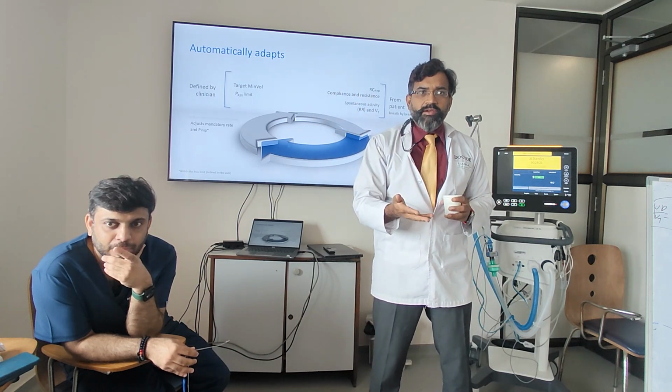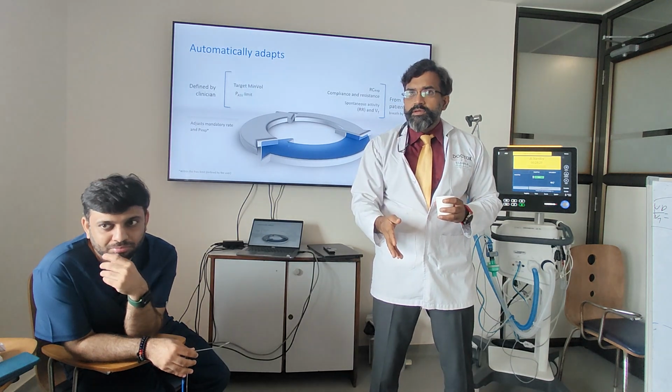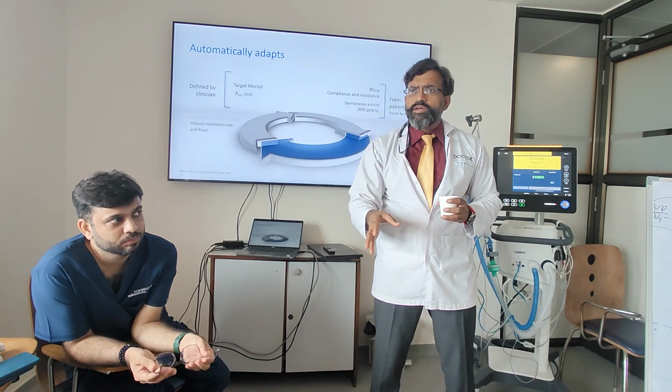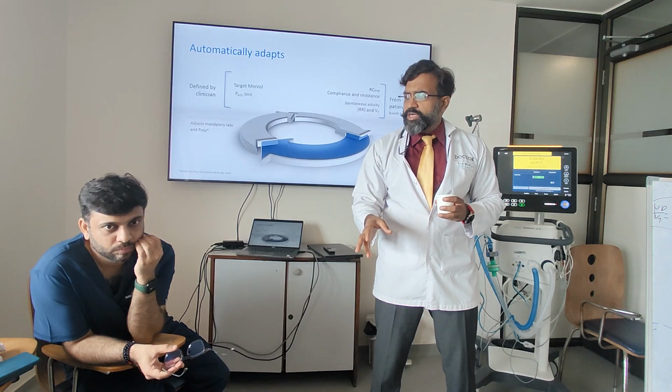But what is effectively happening? In 40 breaths, every breath is 500 ml. You are giving 20 liters. 20 liters of minute ventilation you are giving, which is going to cause lung injury, and other problems that are associated with that.